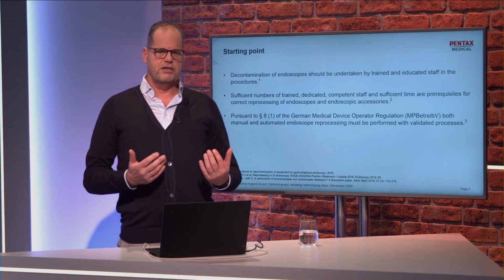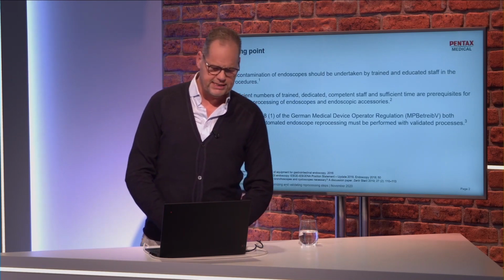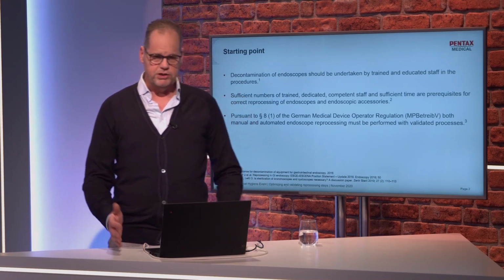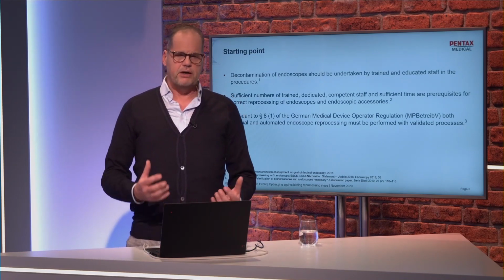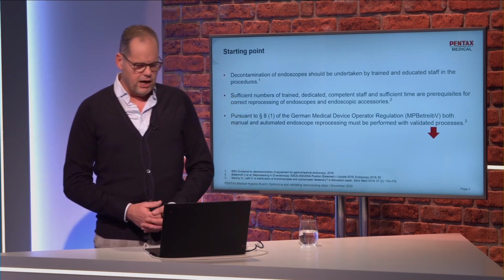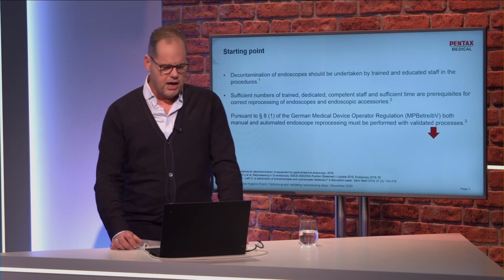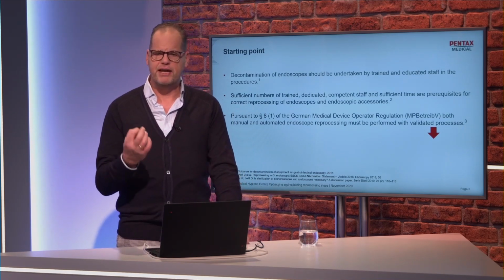And it's, of course, always good to look where we are starting. Our starting point is that the decontamination of endoscopes should be undertaken by trained and educated staff in the procedures. And we also had this topic earlier this morning. It's always about the importance of training and validation, which is also in the statement pursuant to the German medical device operator regulation.